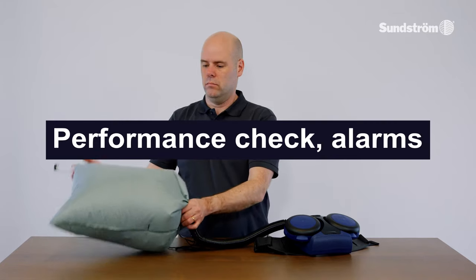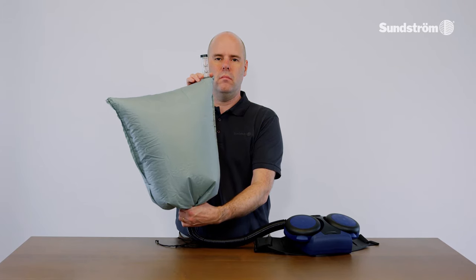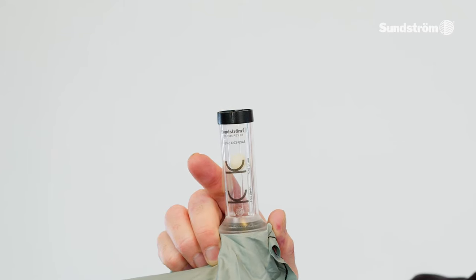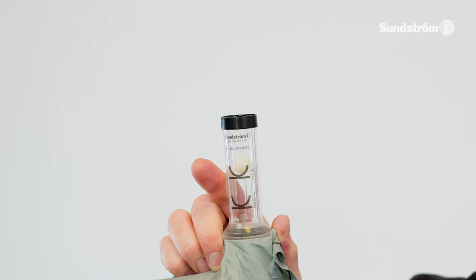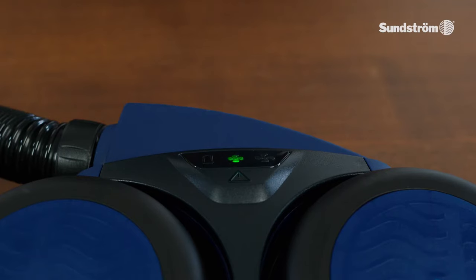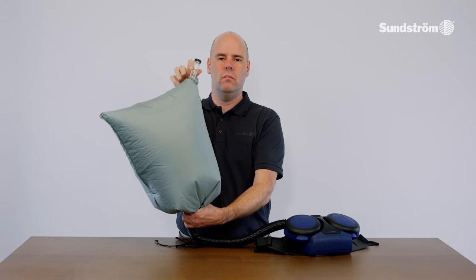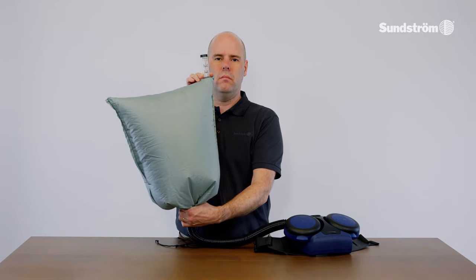Performance check — alarms. The equipment is designed to provide a warning if the airflow is obstructed, and this should be checked in conjunction with the flow check before the equipment is taken into use. Cause a flow stoppage by holding tightly the joint between the hose and the flow meter bag, and then blocking off the flow meter outlet. The fan will now initiate an alarm by audible and visual signals and vibrations. If the flow meter outlet is then unblocked and air is allowed to flow freely, the alarm signals will cease within 10 to 15 seconds.